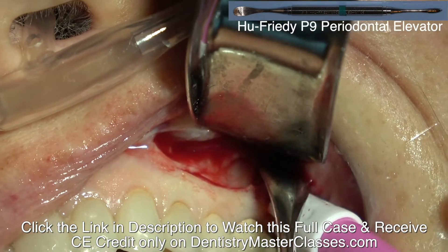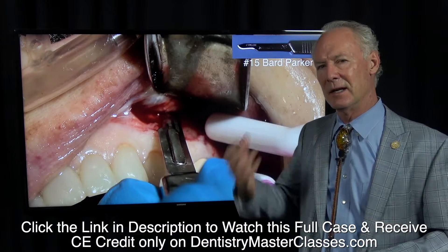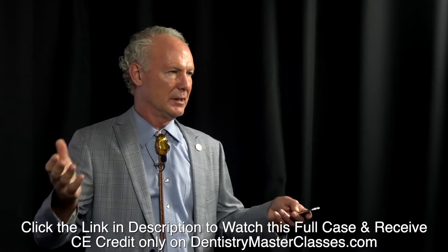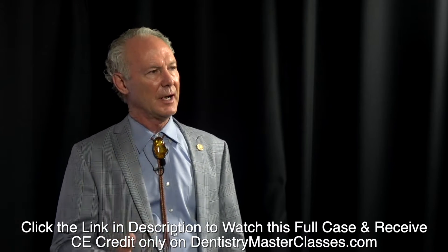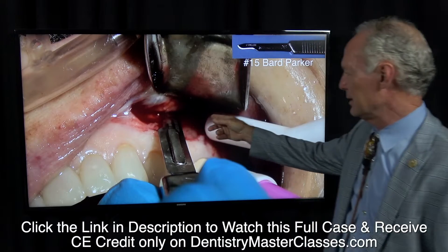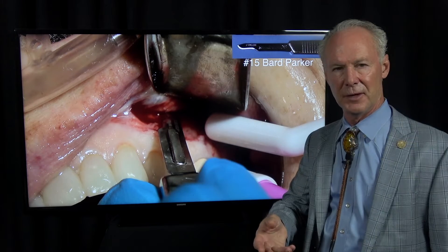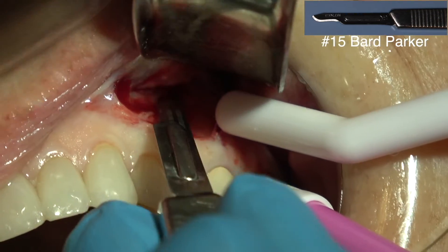Now if somebody has a big lesion on an abscessed tooth, I'll sometimes perform endodontics and an apicoectomy at the same appointment because the lesion is so large. If it's a small lesion, most times I'll just do endodontics. When you graft the lesion, once you've removed the granuloma — if it's a small lesion like this one — I'm not going to graft it. You could, using platelet-rich fibrin and/or freeze-dried bone, but in this case it was a small enough lesion that I'm not grafting it.